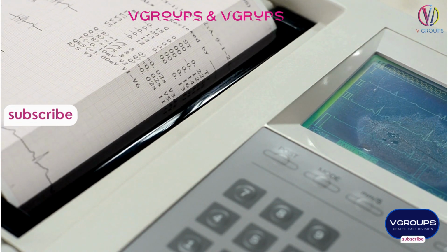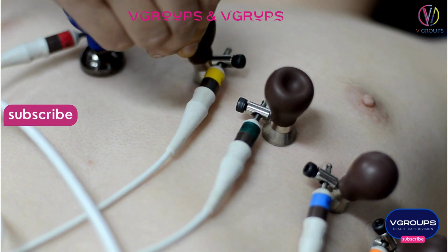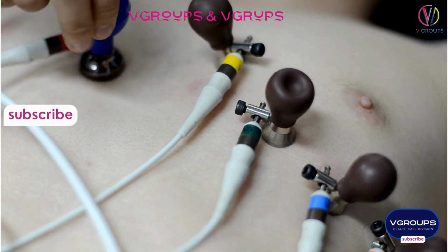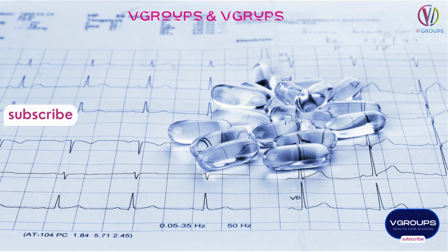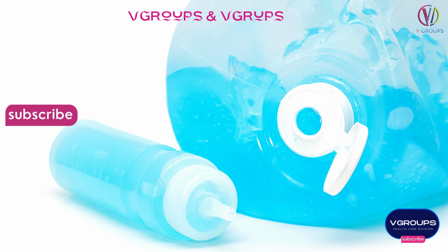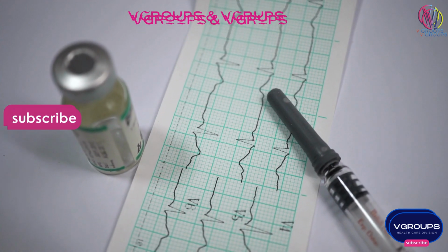Monitoring of high-risk individuals. Individuals with a history of heart disease or those at high risk due to factors like hypertension, diabetes, or family history may undergo regular ECG monitoring. This helps in detecting any changes early and adjusting treatment plans accordingly. Preventive measures based on ECG findings. ECG results guide healthcare professionals in recommending lifestyle changes, medications, or interventions to address specific cardiac issues. This proactive approach can prevent the progression of heart disease and associated complications.